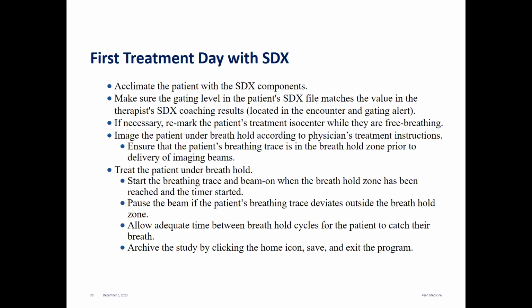Image the patient under breath hold according to the physician's treatment instructions. Our physicians put in treatment instructions that include type of imaging, the target, and the target to align to. Image the patient, of course, under breath hold.